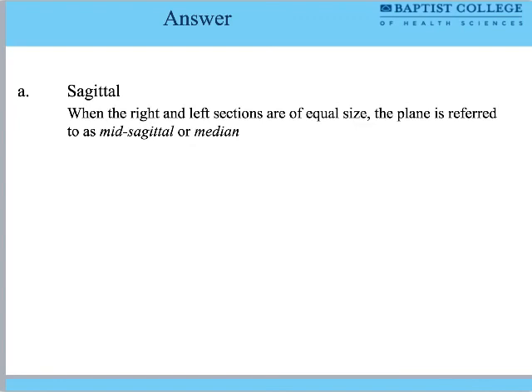So as I scroll through those pictures in the sagittal plane, I'm moving right to left and left to right in the patient's body. So bear with me, kind of stay in that three-dimensional frame. If we're looking at a coronal image of the patient's body, and I'm scrolling back and forth through those pictures, how am I moving through the patient's body? Perfect. Awesome.